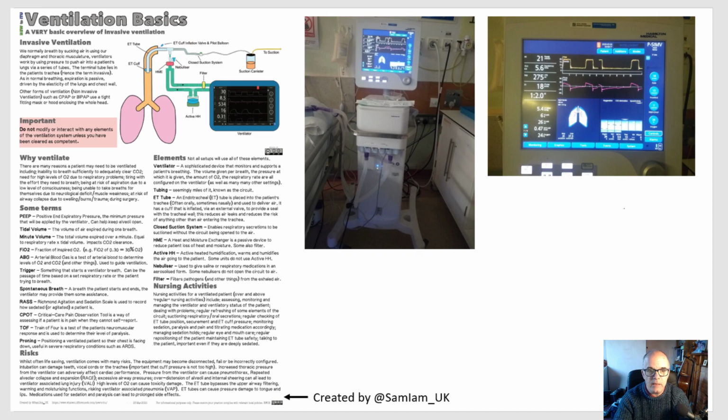So we will ventilate them in order to try and deliver more oxygen to them more effectively and enable them not to become exhausted. So we'll sedate them, we'll put an endotracheal tube down, and then we will take over their breathing for them. The other type is type 2 respiratory failure, where the patient's carbon dioxide levels go up. Typically that's not happening with these patients. They are very much a type 1 respiratory failure. You can have that complicated by some patients with a mixed type 1 and type 2, especially those with underlying respiratory disease. But let's just talk about the type 1s now.